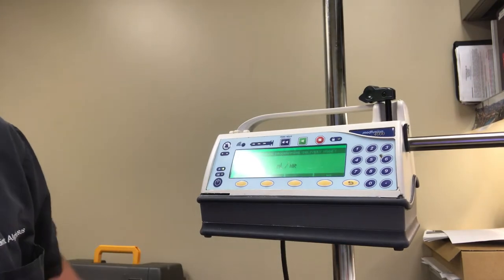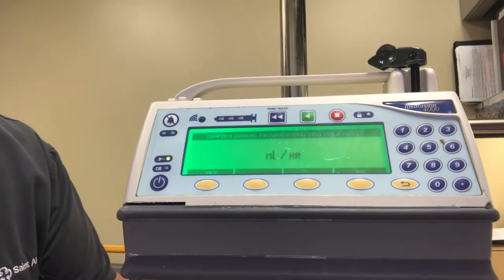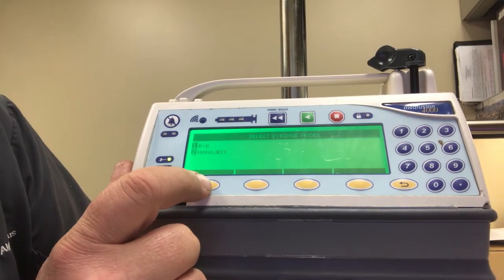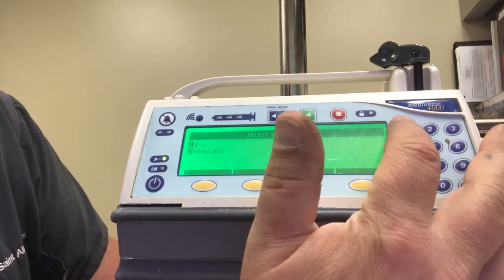So now we can load the pump on there, it's going to have you confirm this, press yes, it's going to ask you what type of syringe you're using, it's a BD, you can see it says BD right here so you press one.